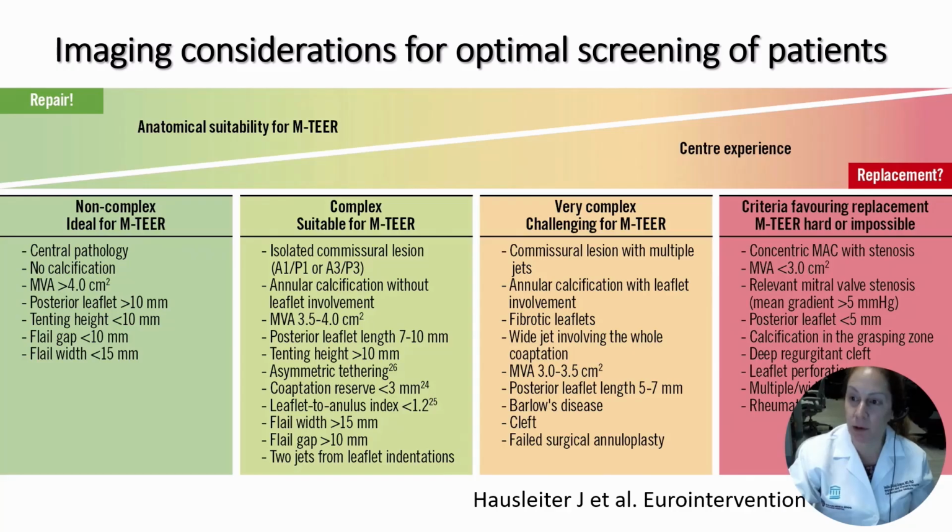But before the MitraClip, according to Hausleiter, we have this nice table showing when a valve is ideal for edge-to-edge repair, when it's complex, and when it's non-favorable, and we possibly proceed to advanced mitral valve replacements such as Tendyne or M3 now.